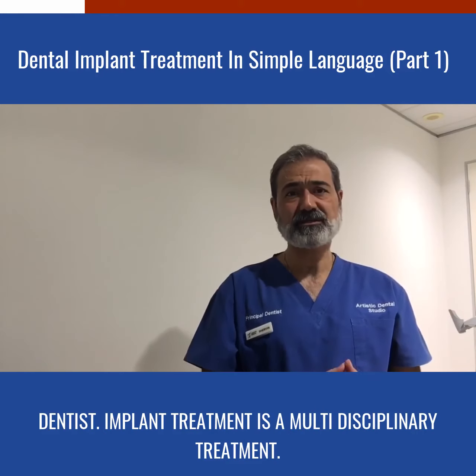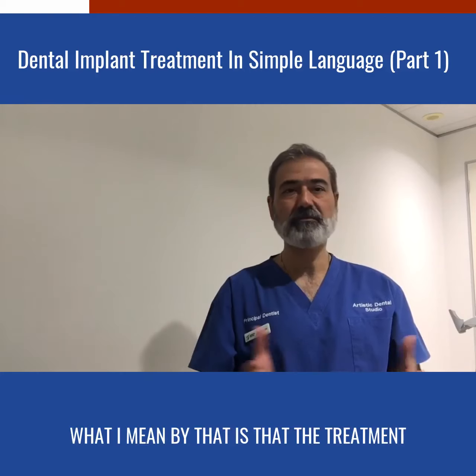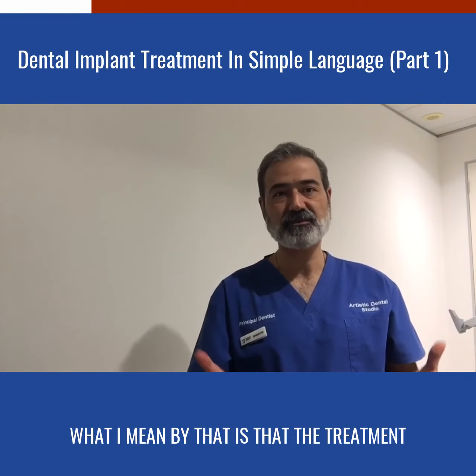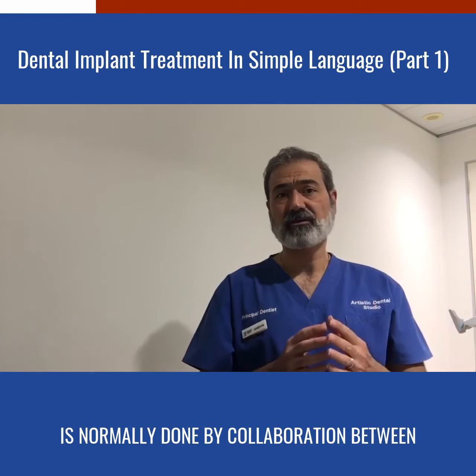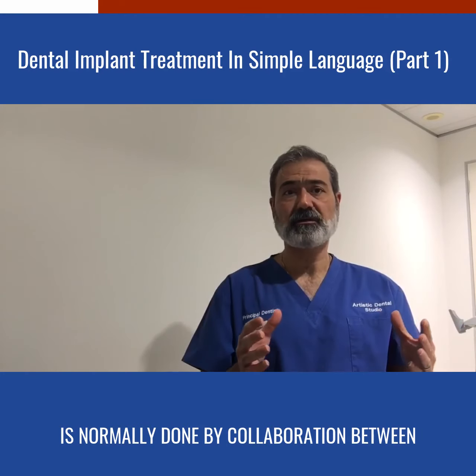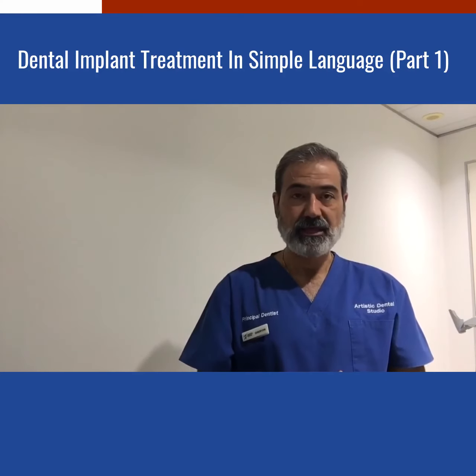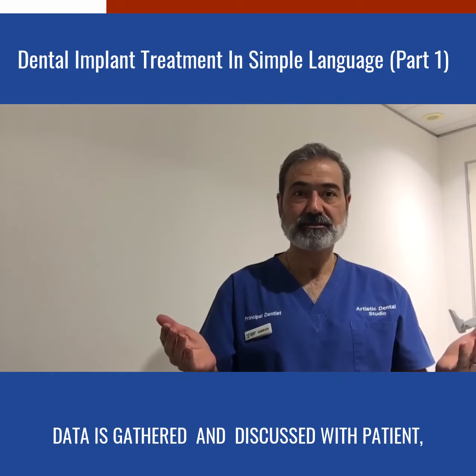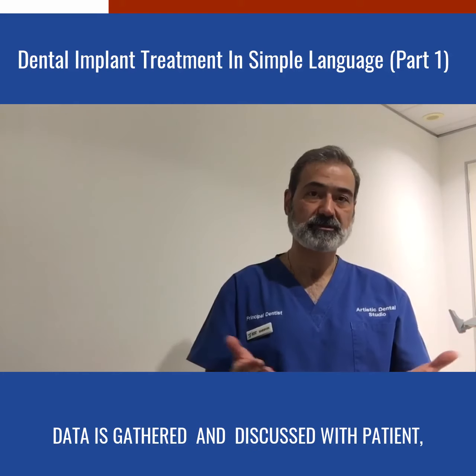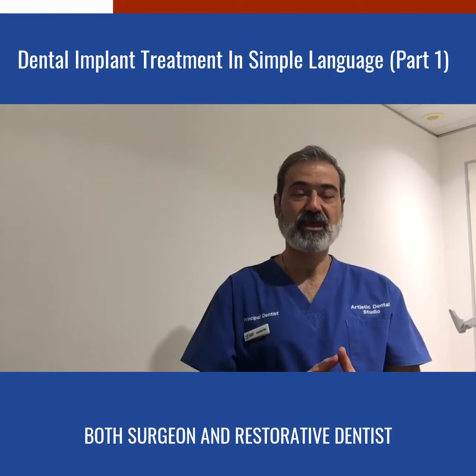Implant treatment is a multidisciplinary treatment. What I mean by that is that the treatment is normally done by a collaboration between surgeon and restorative dentist. The treatment plan is determined after all data is gathered and discussed with patient, which actually constitutes this pre-treatment phase.